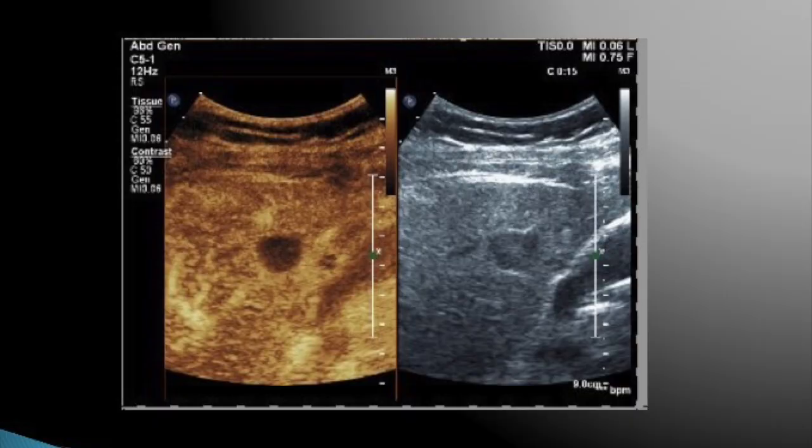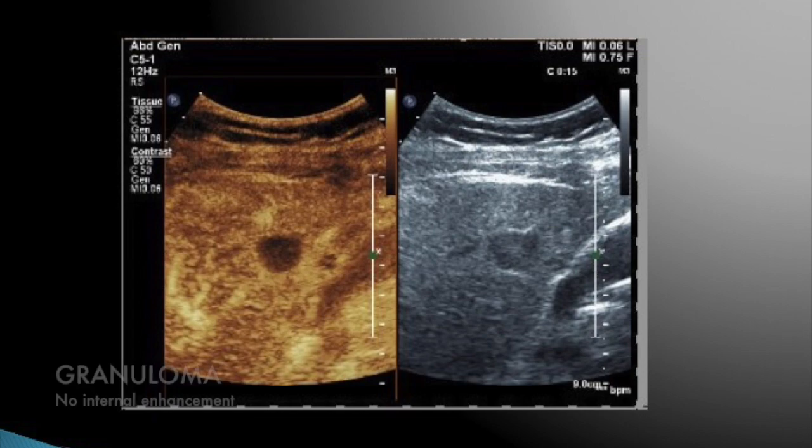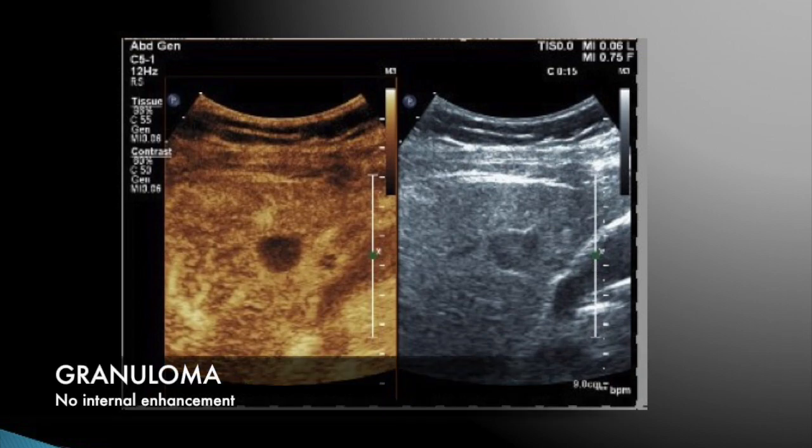Another patient where we saw a hypoechoic lesion in the liver, and on performing contrast ultrasound we saw that there is only peripheral enhancement and there is no internal enhancement at all. So this was actually a granuloma.